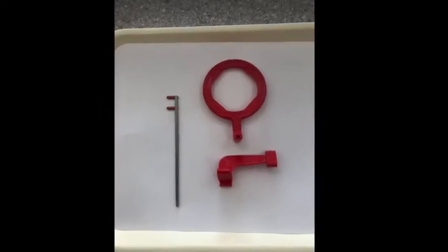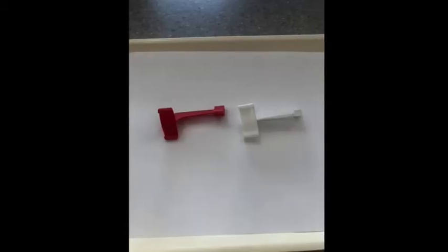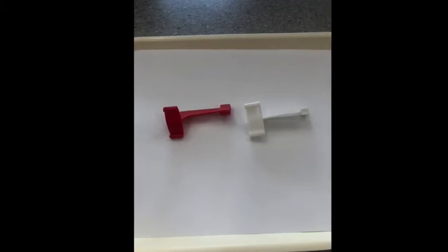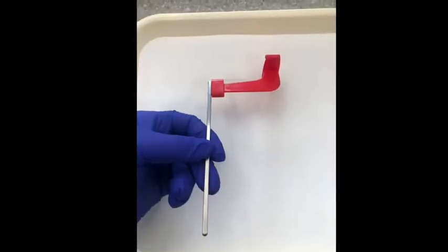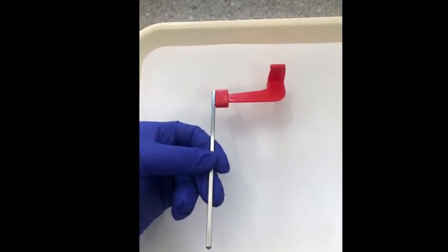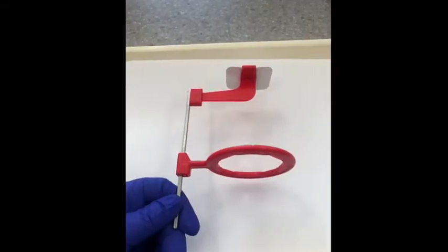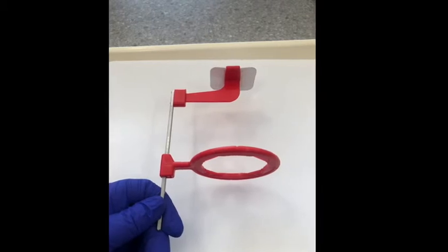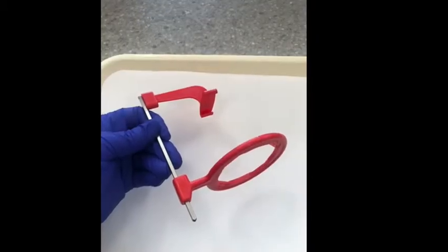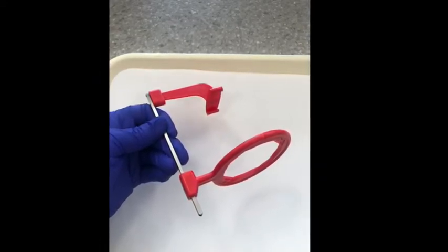Here is the bite wing XCP setup for manual film: the ring, the bar, and the bite block. You'll use the straight bar for bite wings. This does come in different colors — usually white or red. Bite wings are used to see the mandibular and maxillary on the same image, mainly in the posterior to check for caries in between the teeth and bone levels. This would be assembled incorrectly — the bite block is reversed, so you would have to take that bite block off and flip it around.